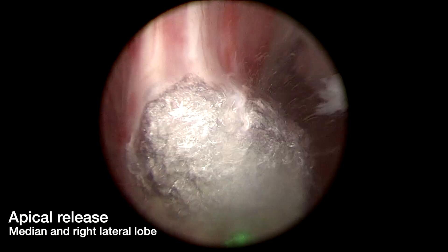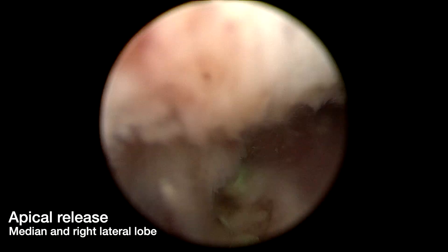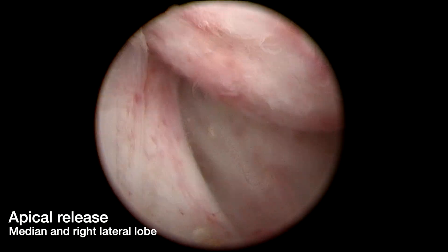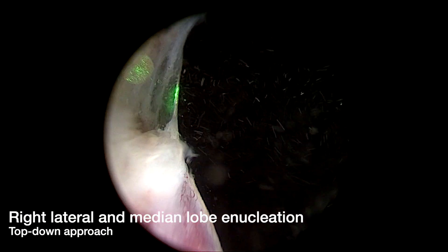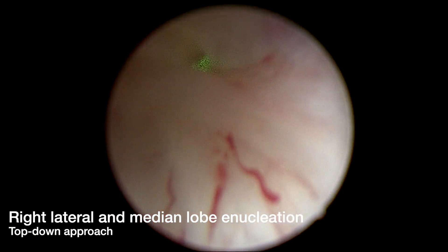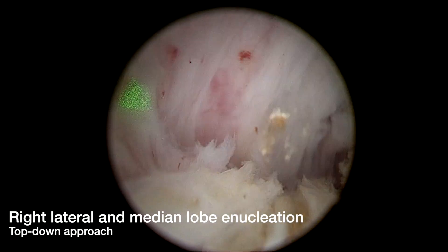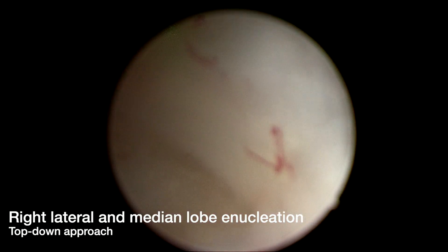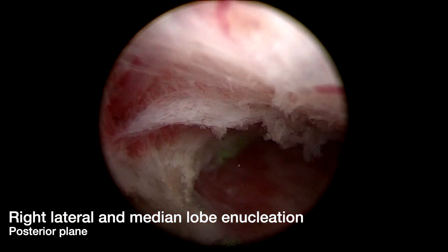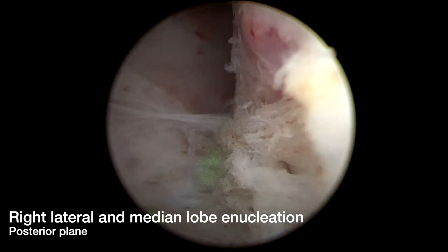Hemostasis of the bed of the left lateral lobe is achieved with a defocused laser fiber. Following this, we turn our attention to the median and right lateral lobe, where we perform an apical release distally. This allows us to further enucleate the posterior plane of the median lobe and the right lateral lobe. Additional anterior plane enucleation of the right lateral lobe and median lobe are performed. We extend our 11 o'clock incision employing a top-down approach, utilizing a combination of blunt dissection and laser enucleation. Here we develop the posterior plane of the right lateral and median lobe, working to join it with the anterior plane previously created.